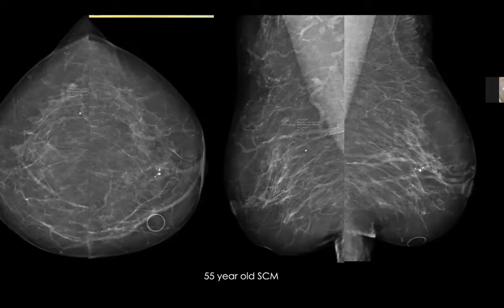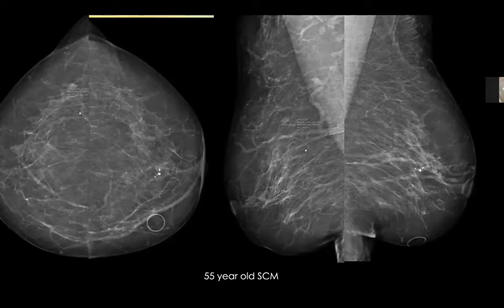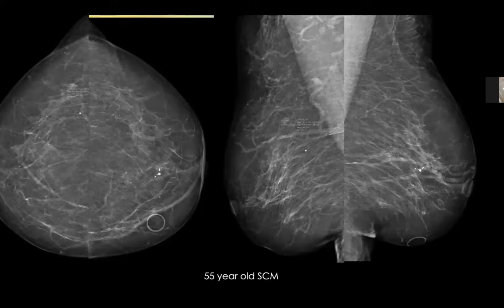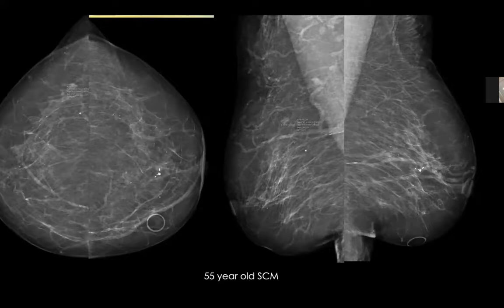This is a good quality mammogram. The pectoralis major is at 20 to 30 degrees to the perpendicular, it is well exposed with good compression, the inframammary fold is visible on both sides, and the nipple is in profile. Draw a perpendicular from the nipple to the back of the film and measure the same on the MLO view — usually they are within one centimeter of each other in a properly positioned radiograph. Look at the subareolar region and the retroglandular area because these are the danger zones. Also look at the so-called 'milky way' toward the axilla in order not to miss a lesion.